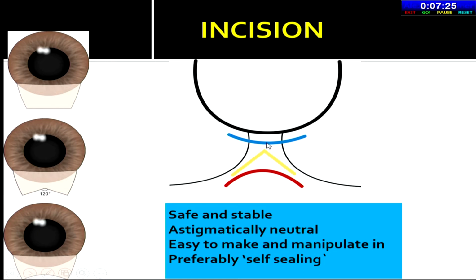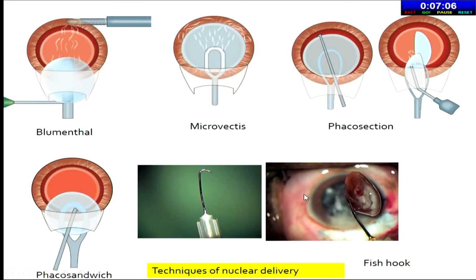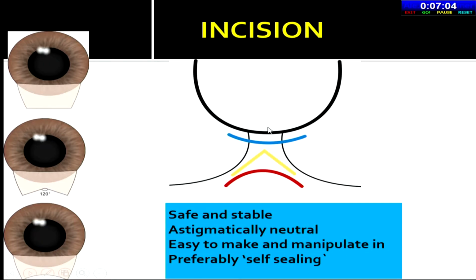The second is that if you want to enlarge this tunnel, how do you enlarge it? The only option is that you move backwards. So that is how the frown incision came into existence. And to further add, now we have started doing 2 straight backward cuts on the same frown incision. Whenever you do the dissection internally, let us see, you have made a good frown incision here and you have dissected internally.